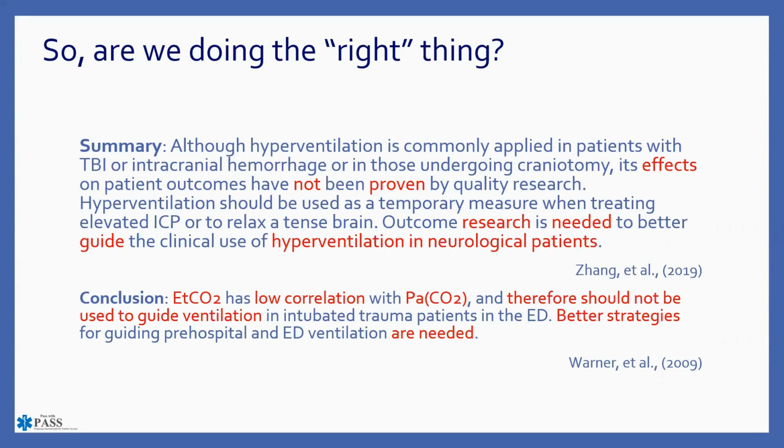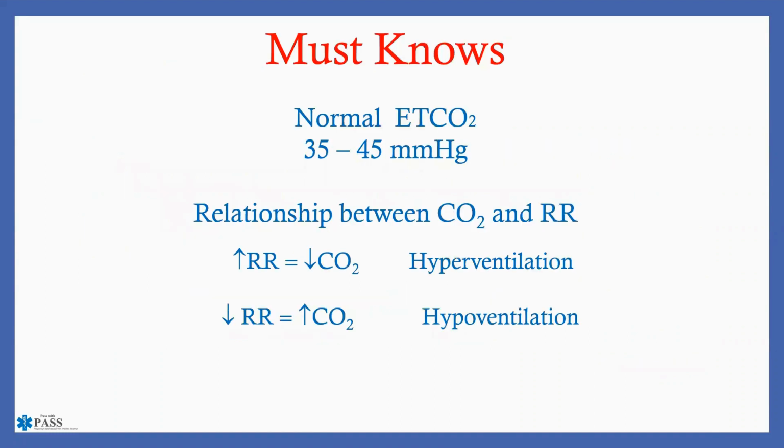I will tell you that all of the research and evidence in today's world in 2023 goes against Warner back from 2009. So while I don't necessarily want you guys doing or documenting that you hyperventilated the patient, certainly put in your report that you ventilated the patient to the low end of normal for capnography or to an area of around 35. I'm just trying to keep you guys out of hot water and make sure that, more importantly, you're doing the right thing for your patient.